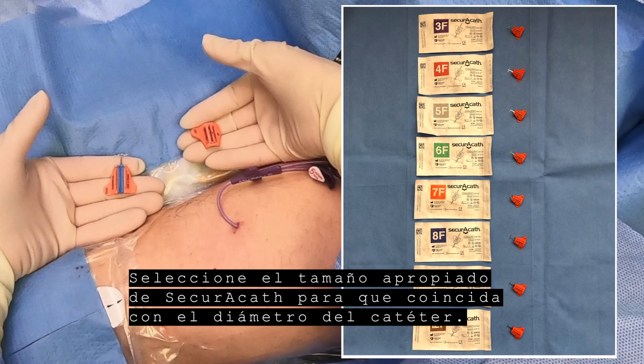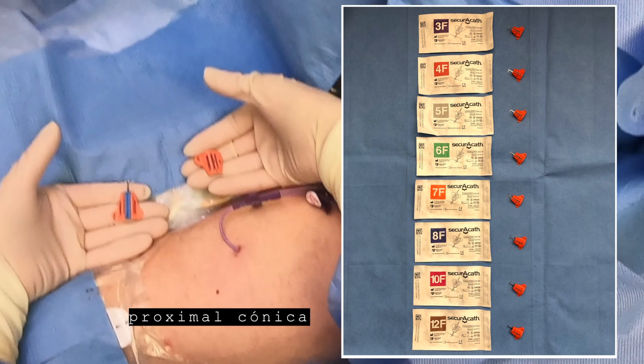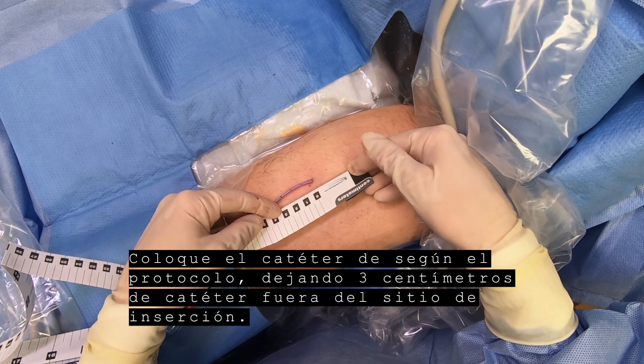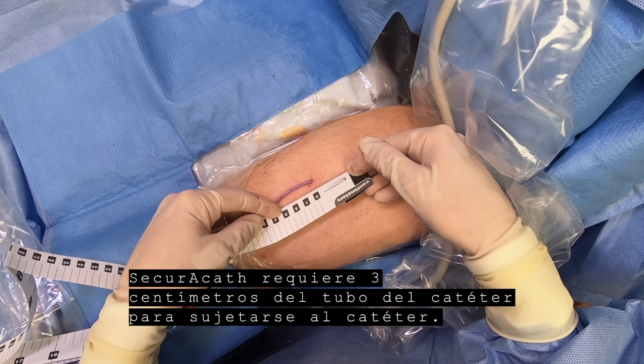Select the appropriate size SecuraCath to match the catheter diameter. The SecuraCath has been designed to work with both straight shaft and reverse tapered catheters. Place the catheter according to protocol, leaving 3 cm of catheter external to the insertion site. The SecuraCath requires 3 cm of catheter shaft to attach to the catheter.